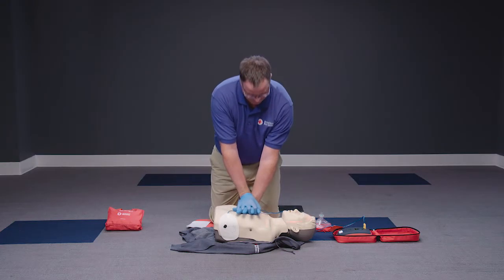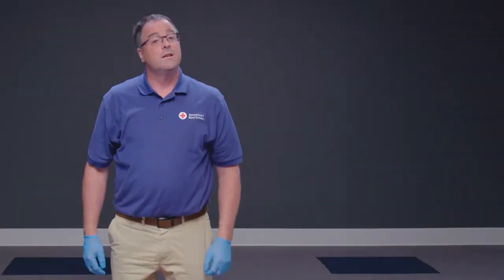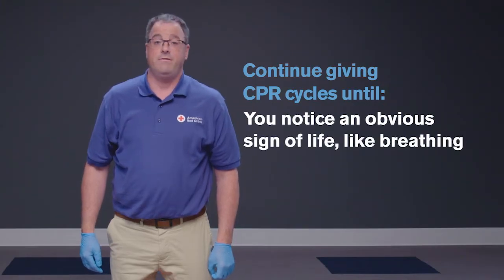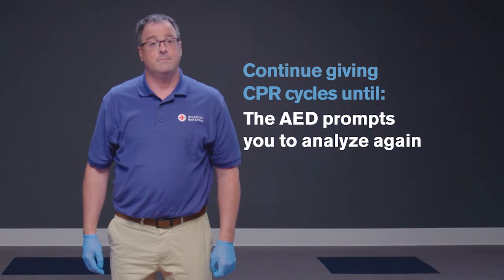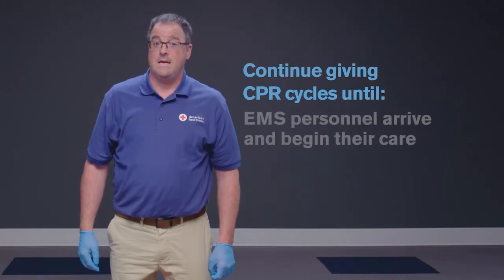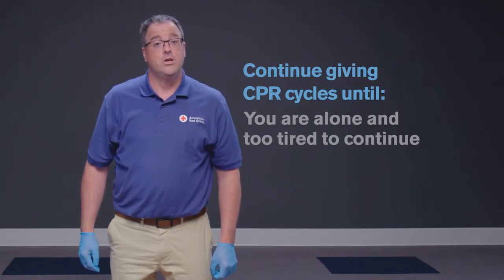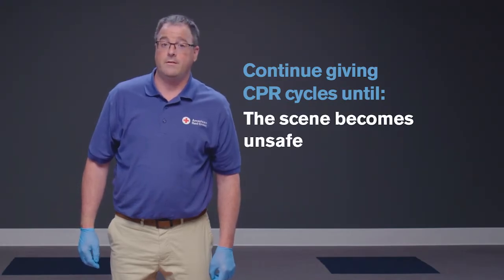Continue giving CPR cycles until you notice an obvious sign of life, such as breathing; the AED prompts you to analyze again; another trained responder is available to take over compressions; EMS personnel arrive and begin their care; or you are alone and too tired to continue, or the scene becomes unsafe.